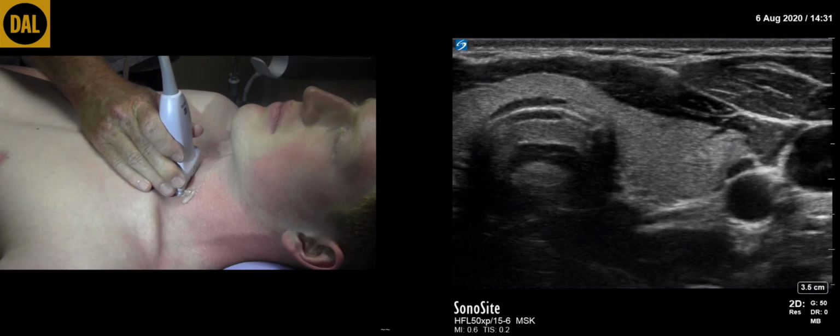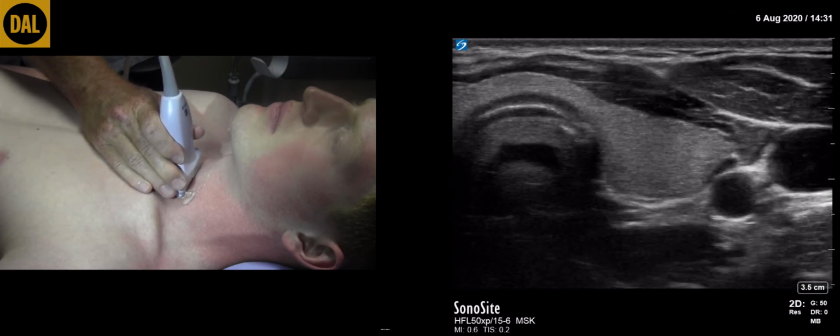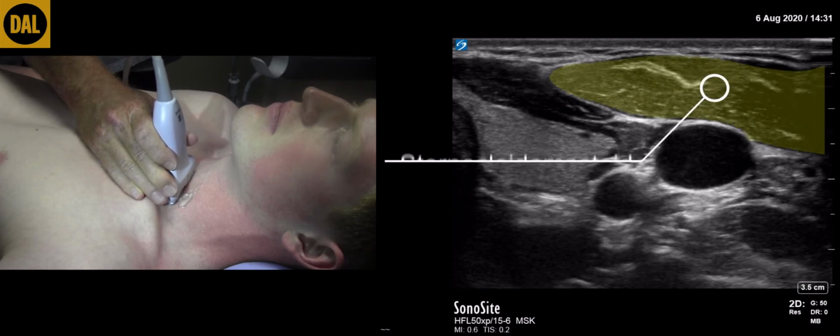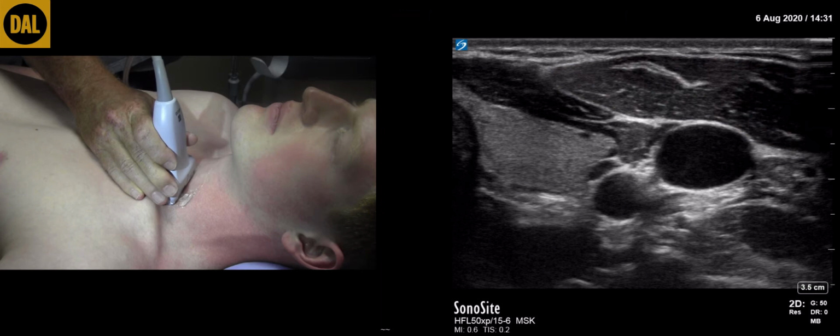Slide the transducer laterally to the patient's left. The sternocleidomastoid muscle is now more prominent. Just deep to the sternocleidomastoid are two anechoic spheres. Anechoic is the absence of echoes and appears black on ultrasound. These two structures are the internal jugular vein and the common carotid artery.